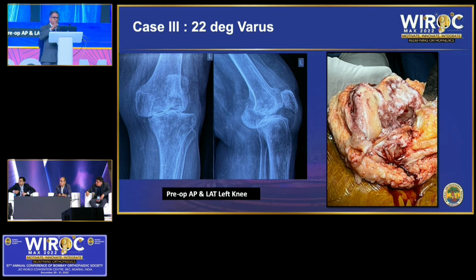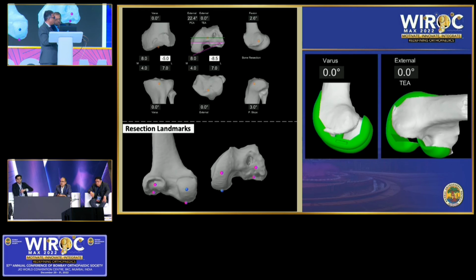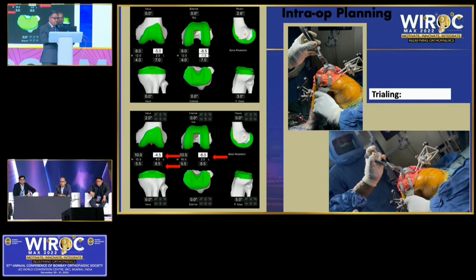But here, why I feel this is disruptive, because this is a case who has got a deficient posterior condyle on the lateral side. So an experienced surgeon will not find it so difficult to place his sizing jig and get the rotation right. But a new surgeon will struggle. Somebody who's 2-3 years post-MS and somebody who's 30 years post-MS will probably have a different outcome in conventional surgery. But the robot will pick up the rotation quite easily because it's going to go by the transepicondylar axis. It doesn't need to know where the posterior condyle is. And probably the outcome in the hands of both the surgeons will be the same. That's what actually I have seen also.